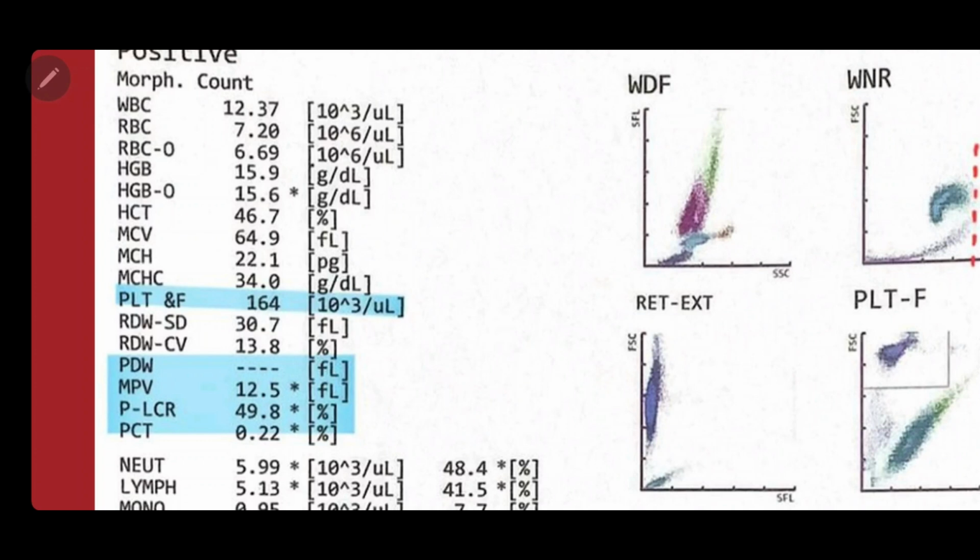Therefore, in current research related to blood, we primarily use RBCO rather than RBCI due to the latter's considerable variability and several influencing factors. These include fragmented red blood cells, high MCHC, or certain conditions that cause RBCI to measure inaccurately, which I will explain later. As for hemoglobin, or the oxygen carrier, the normal range is 12 to 19. For packed red blood cells, the normal range is 35 to 55.